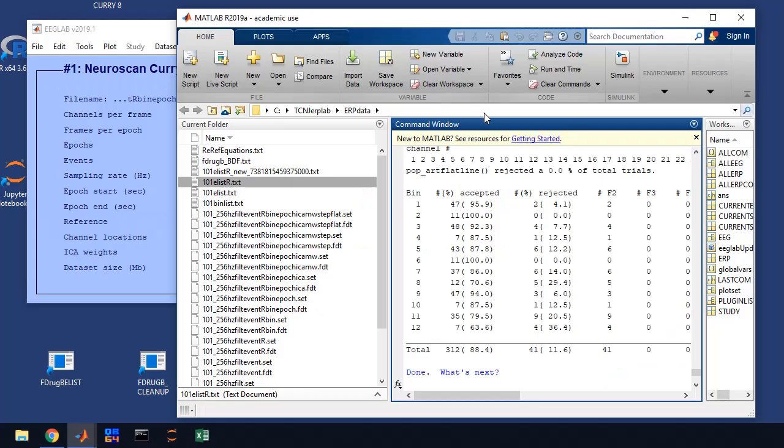Okay, so we've taken our EEG data and we've removed all the artifacts. Now we're ready to clean up a few things and form our ERPs.